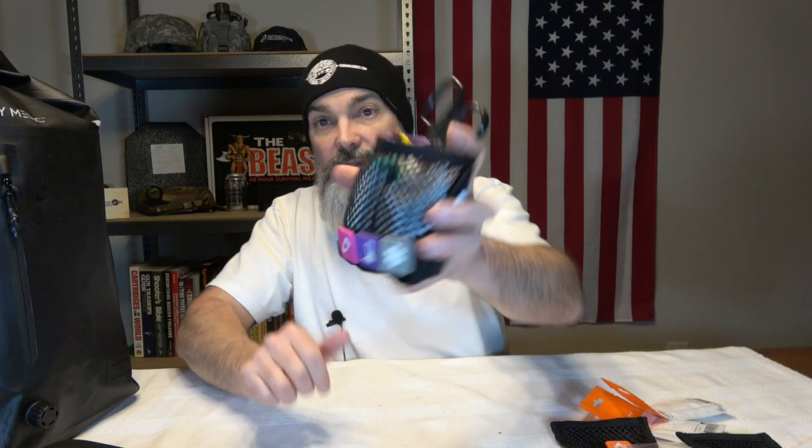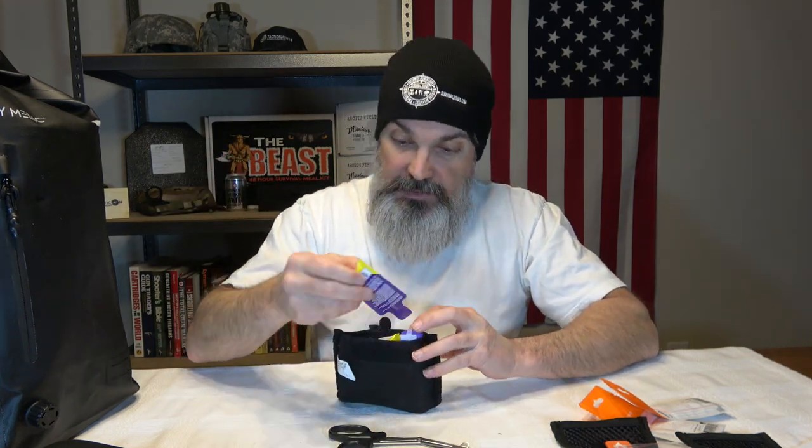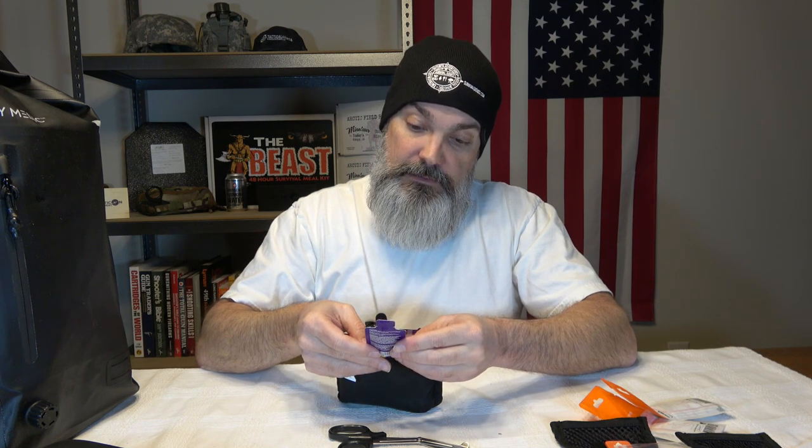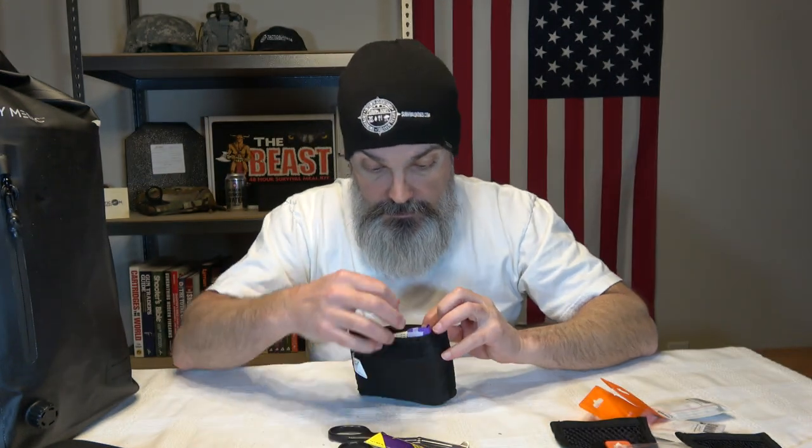Then we've got a compartment that looks like it's going to have a splint, some creams, and then the one that just says first aid. We've got some shears — some clothing shears — and then some anti-chafe cream. We've got two of those. And a mini sprain and fracture kit. This has a finger splint and a one-inch by 15-foot self-adherent bandage roll.